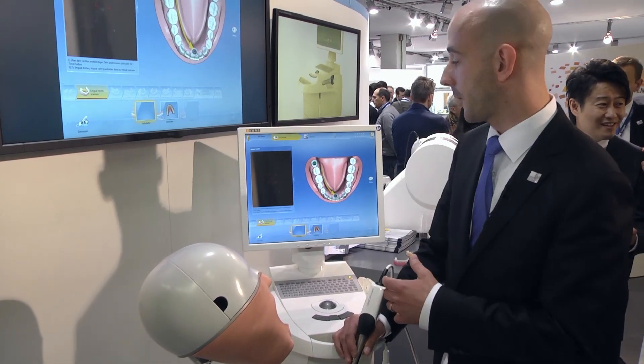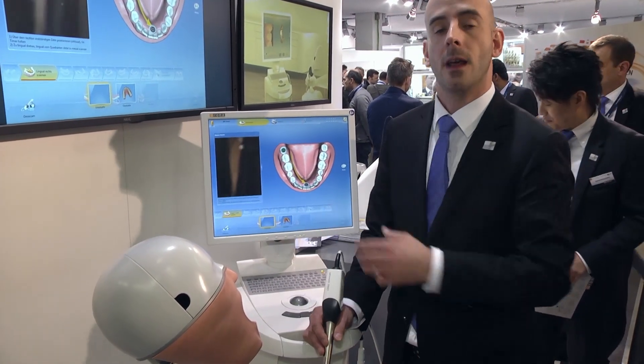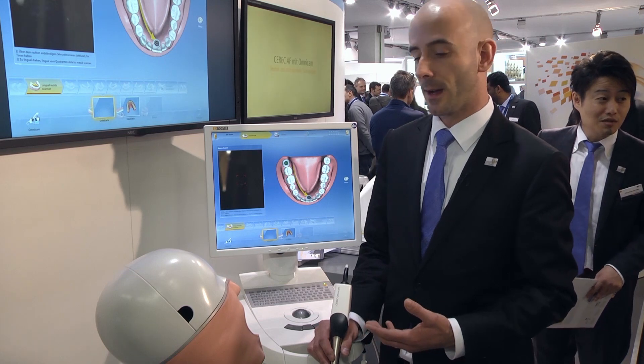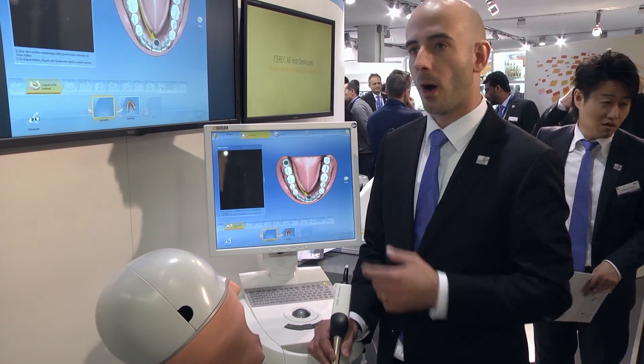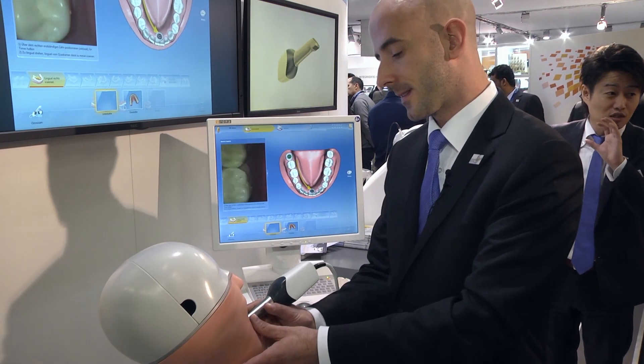The scanning process itself is very easy. We have symbols and messages on the screen that explain to the user what needs to be done, and also some audio cues as well. The scanning is very simple.